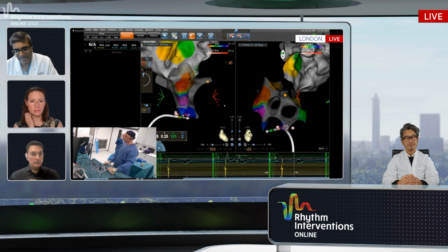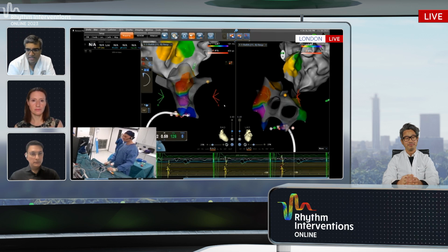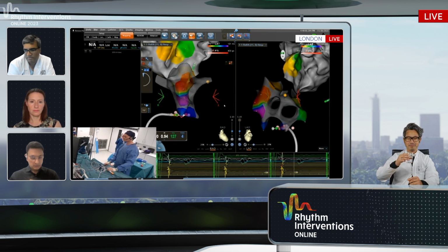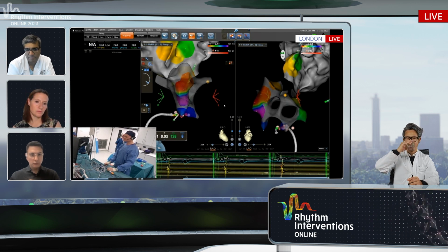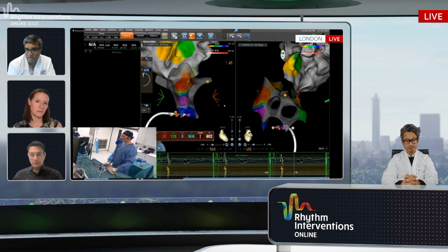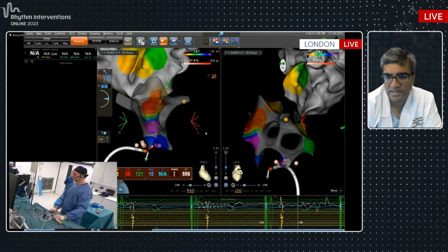Yeah, I got it, but look, a couple of things. First, in this particular case, I would look for other atypical flutters by induction, not necessarily empiric ablation. Number two, I would also look for other initiators.